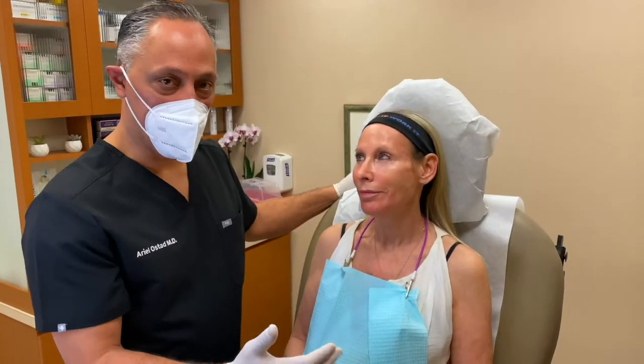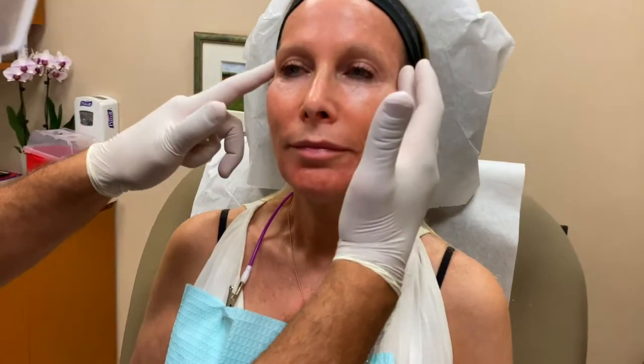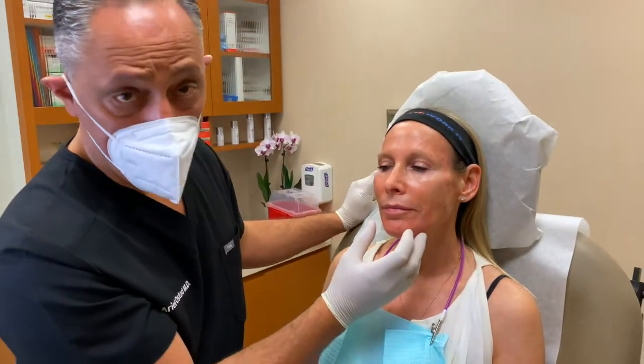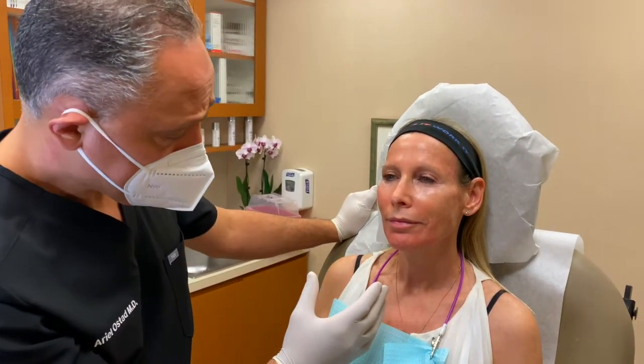So now that we're done with fillers, I just wanted to show you what we have done here. As you can see how she looks even better. Her temples are filled in. She could use more here, but just for the purpose of addressing the major areas, I stopped at 1 syringe on each side. You can see how she has really beautiful cheekbones. One of the major things that I noticed on her is this mid-cheek hollowing. So we addressed that with fillers. And then you can see how we addressed her chin and the fact that she had this receding chin. And we basically made it very proportional by putting fillers here.